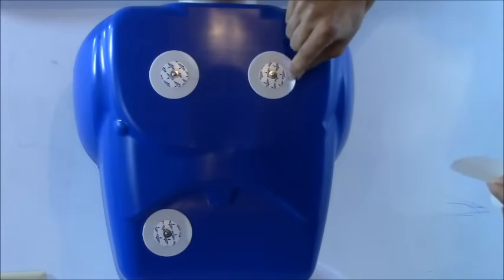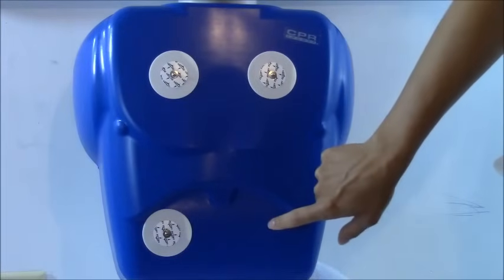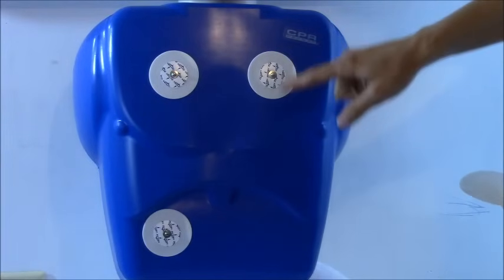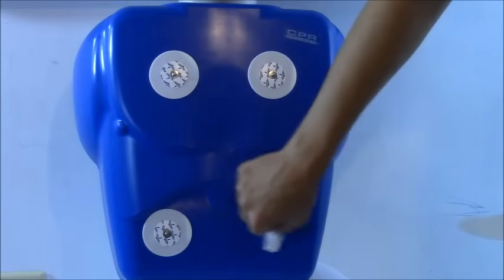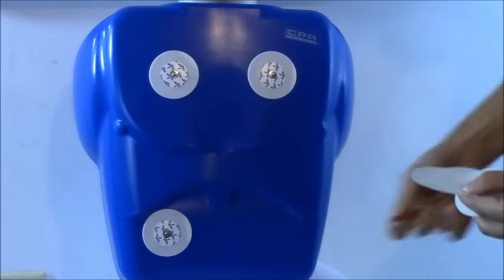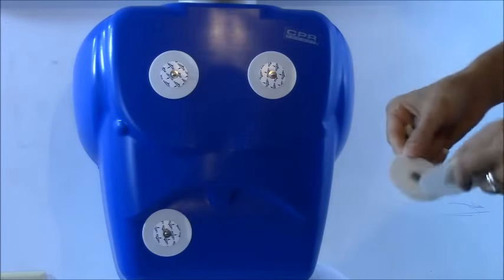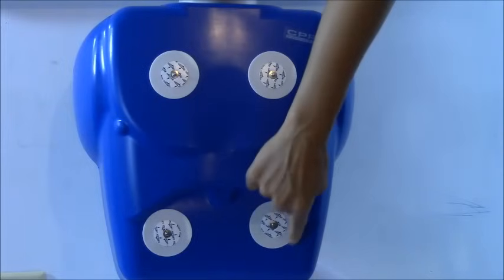Second intercostal space. And this is the black lead. And this is going to be our left lower leg. And this is going to be the red lead. So you have smoke over fire. So clean that area. And this is literally right across from your right leg lead. And it's on the lower part of where the rib cage is on the non-muscular area.